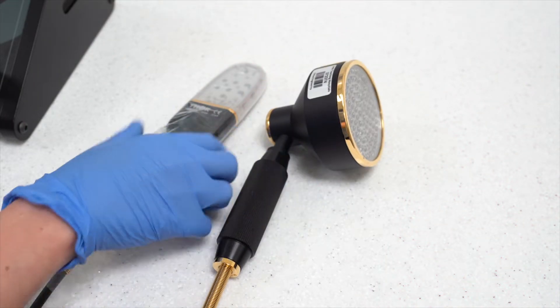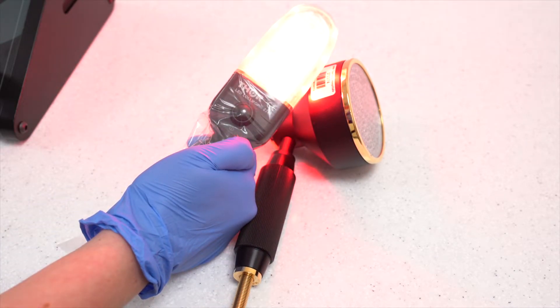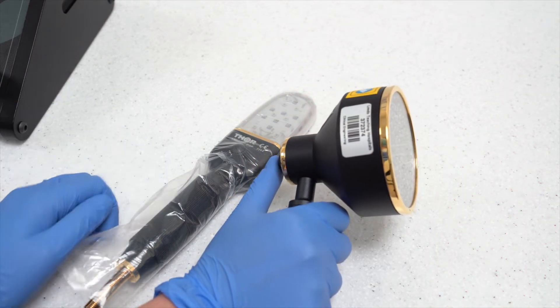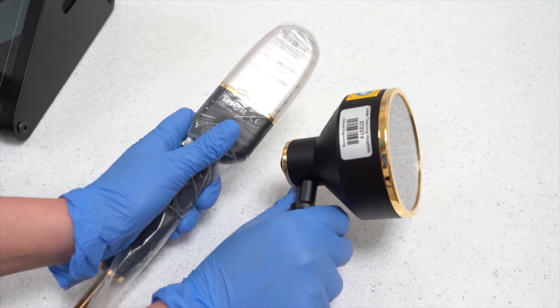After this time has elapsed, the light will automatically turn off and the treatment will terminate. We have shortened the exposure time to demonstrate this in this video. In an emergency, pressing the activation button again on the relevant probe will terminate the treatment. Alternatively, the emergency stop button can be utilised.